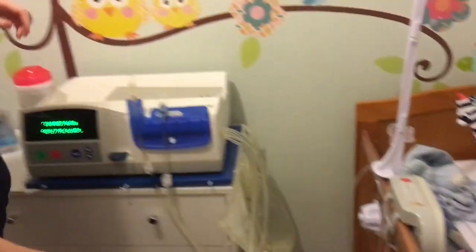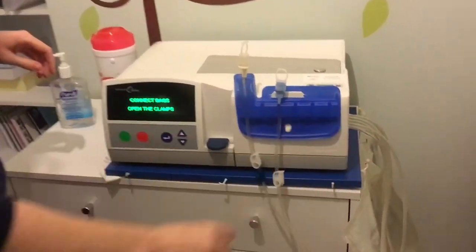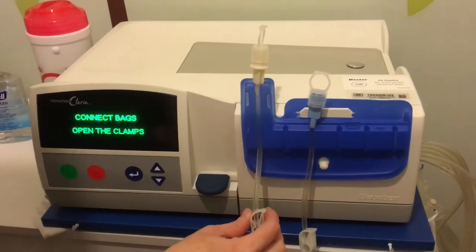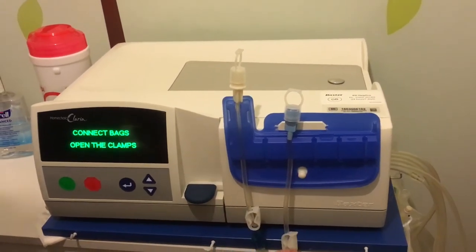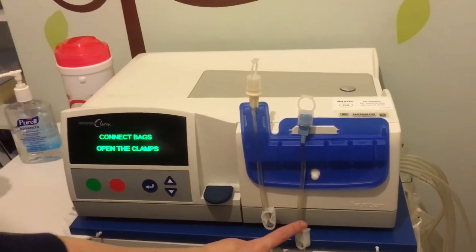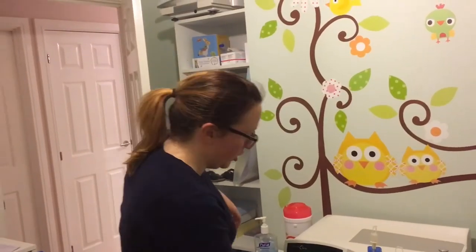So that's all the bags and the clamps open down there, and then we've just got to open this clamp. This is called the patient line — that is the line that will be attached to Ethan. We've got to open the clamp there because the liquid has to get up to the top. This one we're leaving clamped because it's an unused line. If he were a bit bigger and needed more fluid, we can attach another bag to that one, but since he's still little we don't need it just yet.